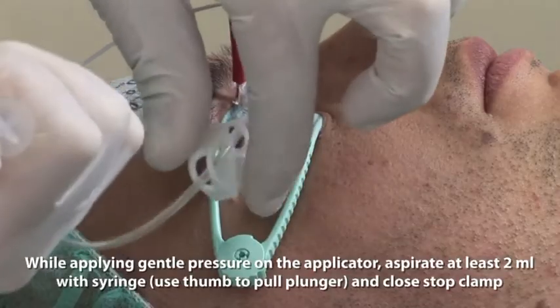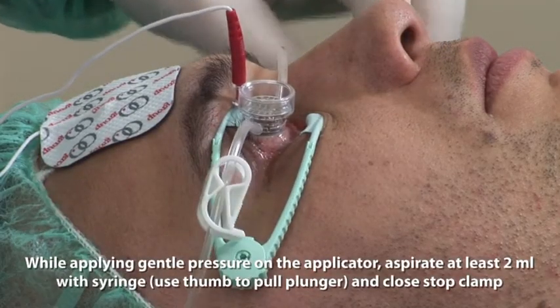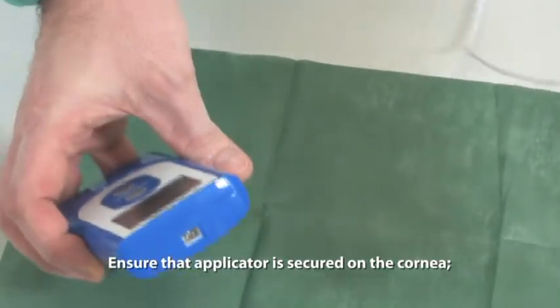While applying gentle pressure on the applicator, aspirate at least 2 ml with the syringe, use the thumb to pull the plunger and close the stop clamp. Ensure that the applicator is secured on the cornea.